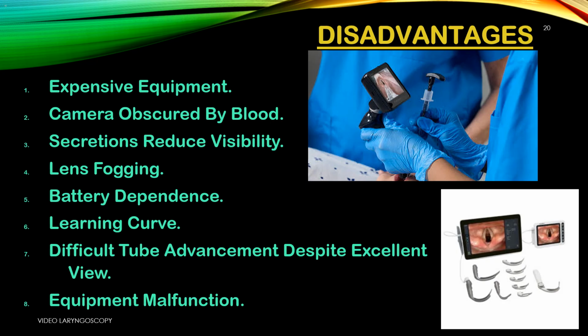4. Lens fogging. Warm humid air from the patient can fog the cold lens. Reduces visibility at the start of the case. 5. Battery dependence. If the battery dies or isn't charged, the device is useless. Always need to check power first.